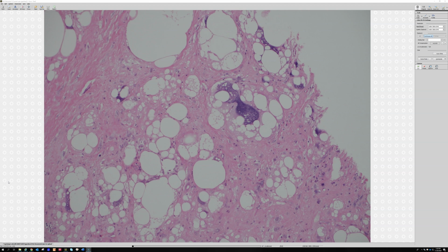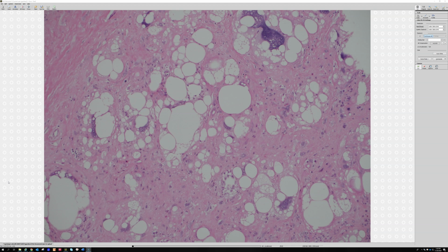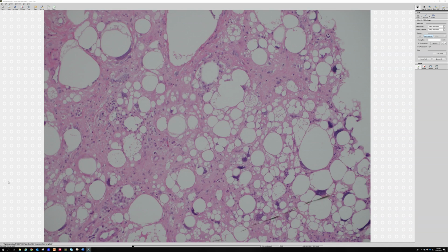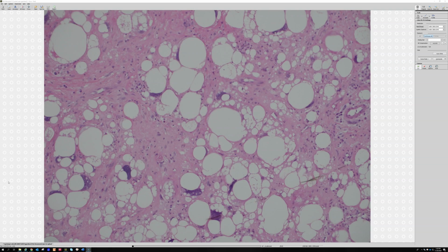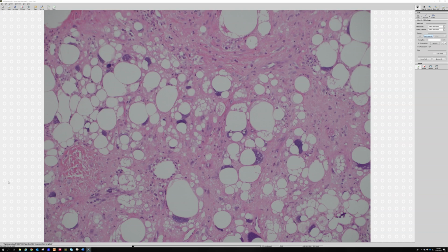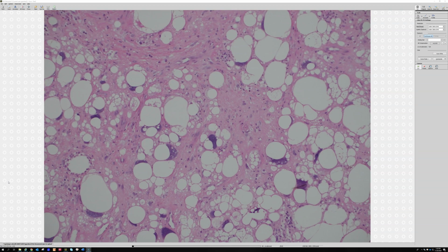The one thing that helps me is if I take away the scattered atypical cells and lipoblasts, am I left with a high-grade sarcoma in the background? And if the answer is no, then in general I tend to be more on the side of well-diff liposarcoma. So this is an example of a challenging one that's not a classic straightforward case, but I like this one because it's so nice to be able to easily see really good examples of lipoblasts. I mean, they're just everywhere here.